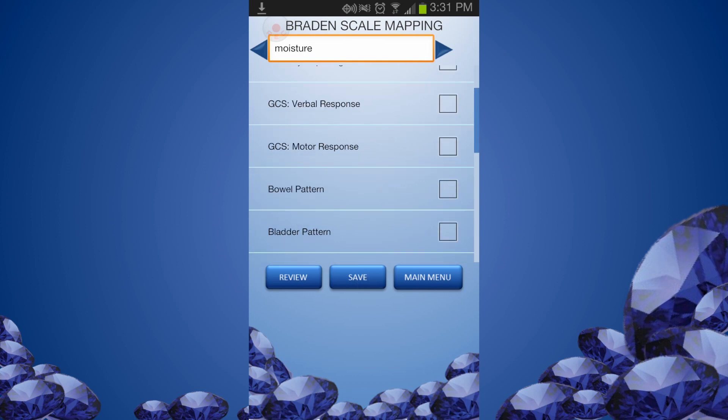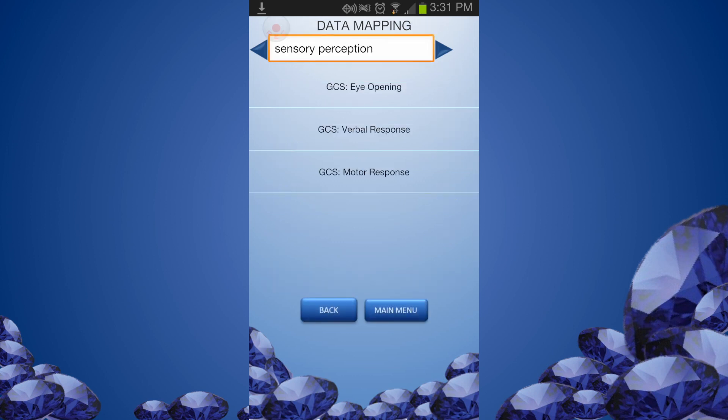You can move to the next parameter using the scroll arrow. You can also review the association at any time by clicking the Review button.